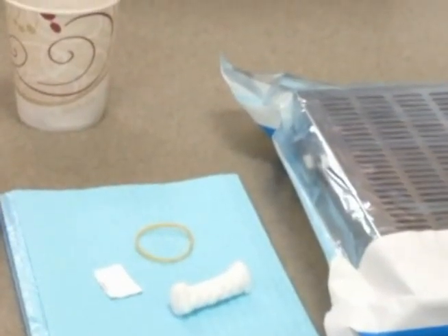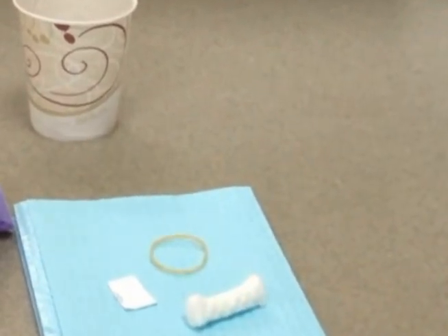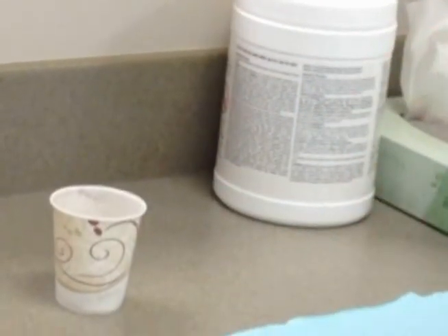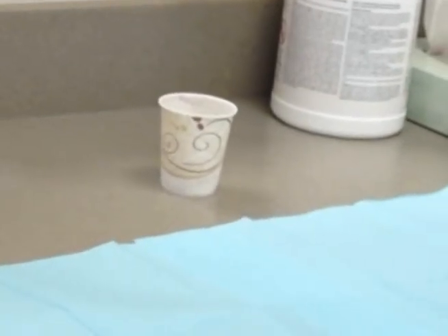Next, place two blue napkins on the countertop of the radiology unit you will be using. These should be located on the countertop next to the computer monitor. These napkins are where you will lay out your XCP instruments and film. Once you lay out the napkins, you will want to cover the exposure button with barrier film, which can be found under the button on the countertop.